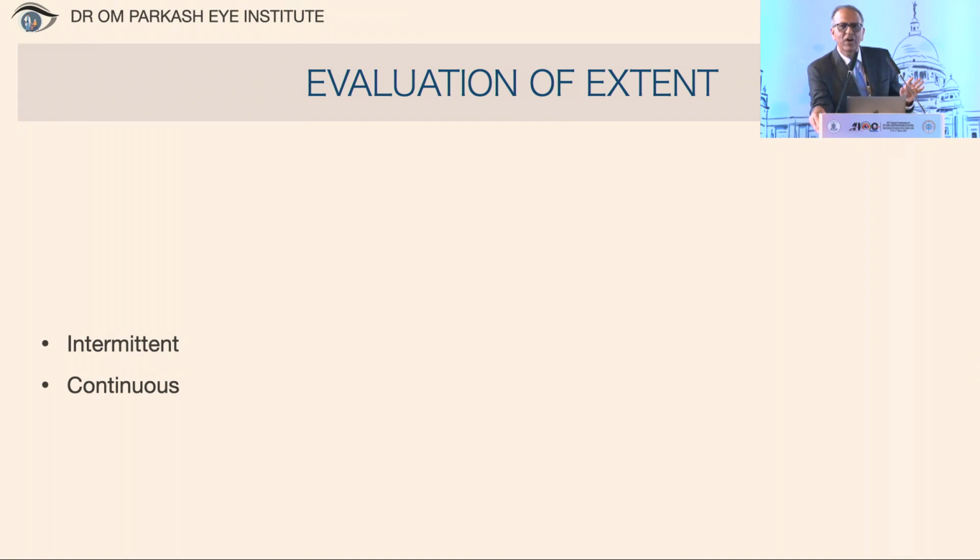Next question is, how do we evaluate it, because we are busy doing the surgery? Well, there are two ways. When you are doing the surgery, you can intermittently have a look, or secondly, you can ask your assistant and tell him to have a look at the flap. And in our OR we have assistants who really let us know whether it is fluttering or not.